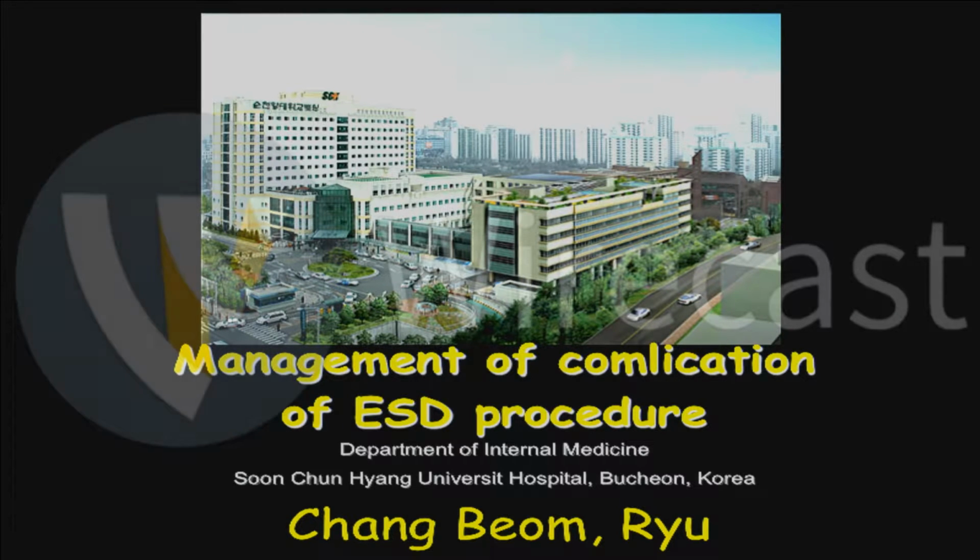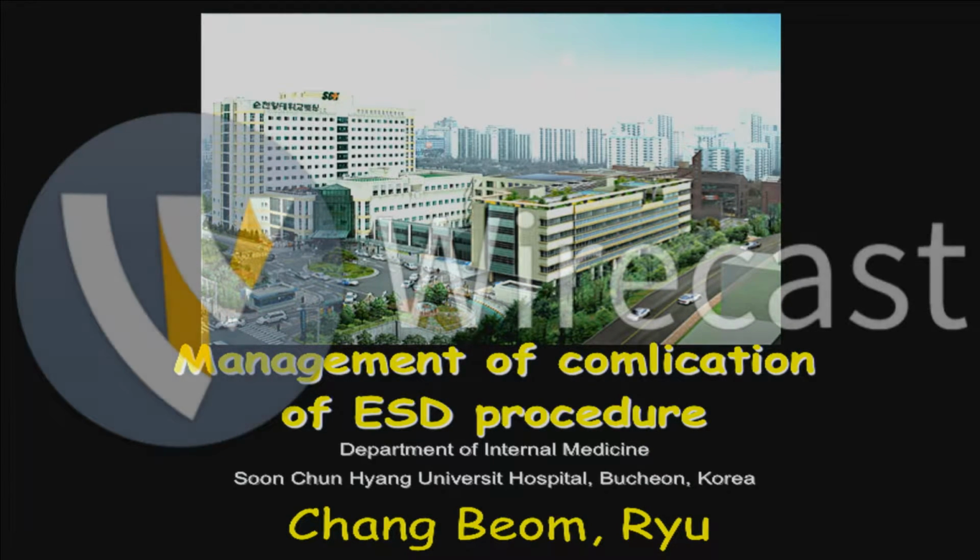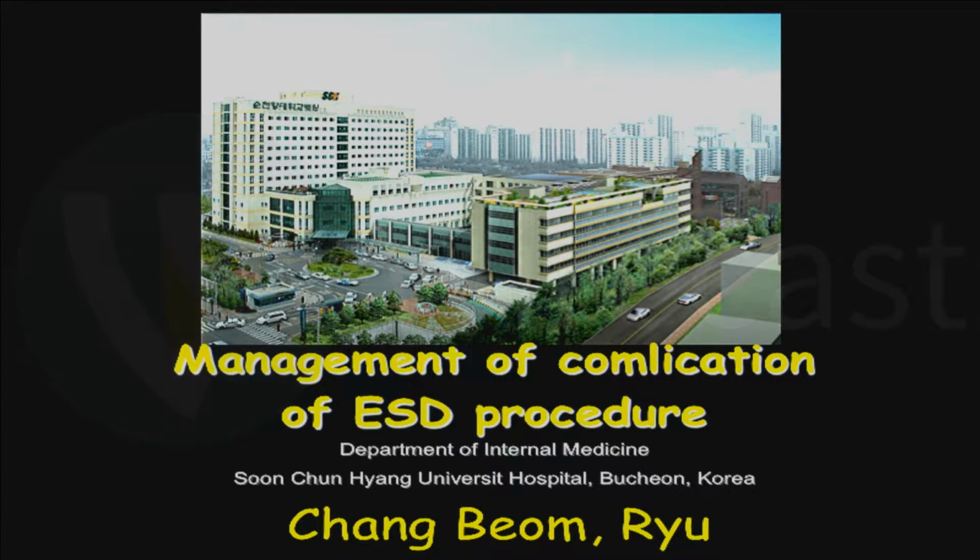Today, I'd like to talk about management of complication of ESD procedure. After finishing my presentation, please don't misunderstand me as a complication doctor. This is my 15 years experiences. Almost all mistakes were made by the beginning period. It would be good lesson for all of you, I hope.